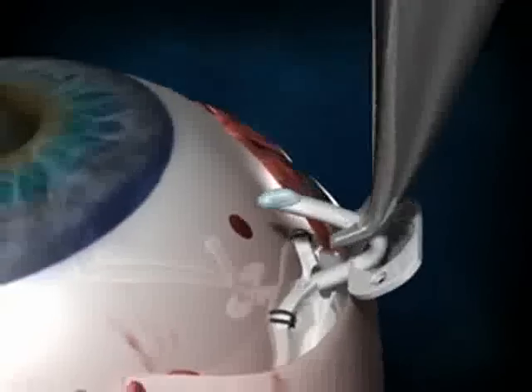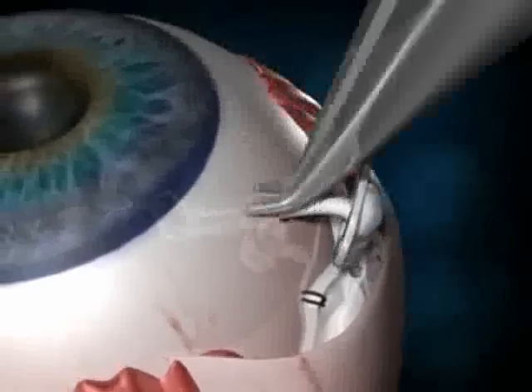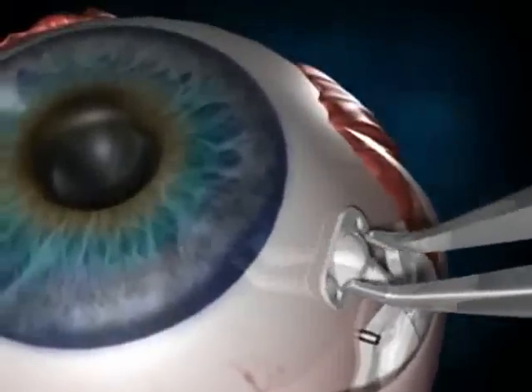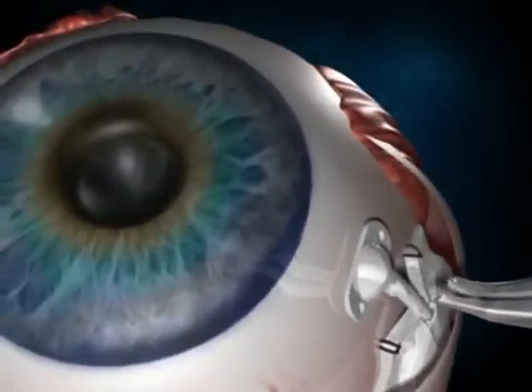Move the clip over the tube so that the end of the tube can be inserted into the 23 gauge needle track. Make sure that the implant tube is placed in the area where the partial vitrectomy was performed.